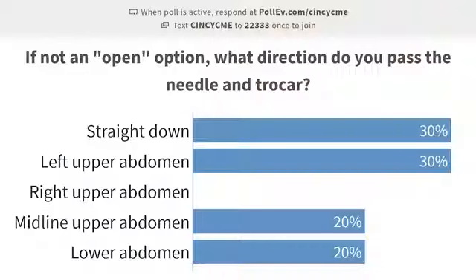In fact, even if I'm going to help a resident or fellow, I oftentimes stand on the right to put the first trocar in, and then we move. It depends on which side of the patient you're on. Well, I know I'm going to do it safest. Okay. So straight down, I would say that's not really what we want.